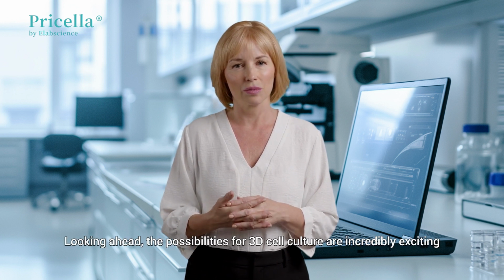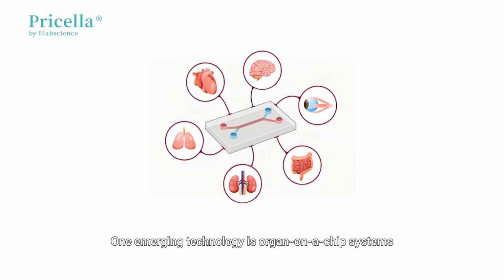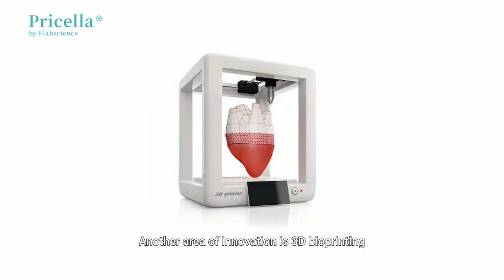Looking ahead, the possibilities for 3D cell culture are incredibly exciting. One emerging technology is organ-on-a-chip systems, which combine 3D cell culture with microfluidics to create miniature, functional models of organs. These systems allow researchers to study how organs interact with drugs or diseases in real time. Another area of innovation is 3D bioprinting, where researchers use specialized printers to build complex tissue structures layer by layer. This could eventually lead to fully functional, lab-grown organs for transplantation.